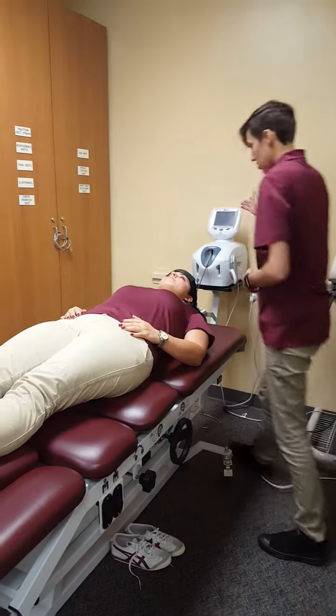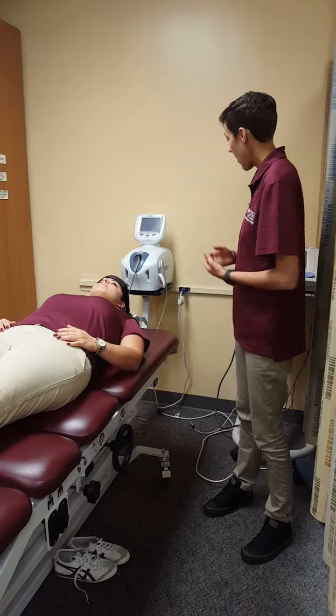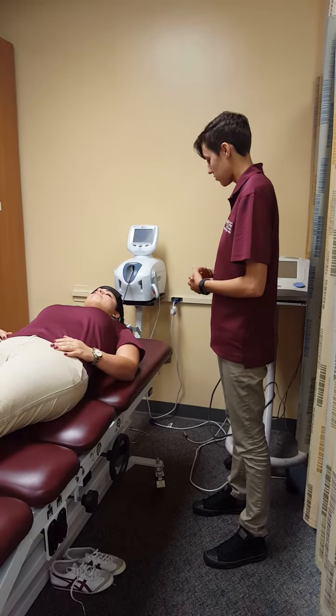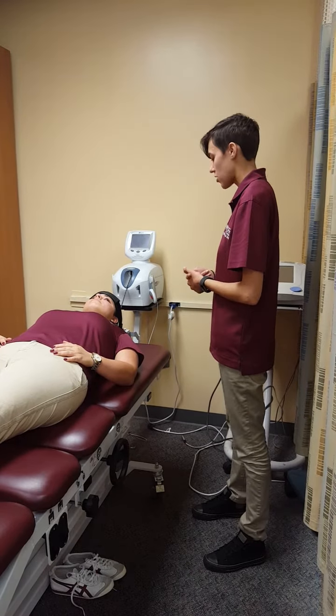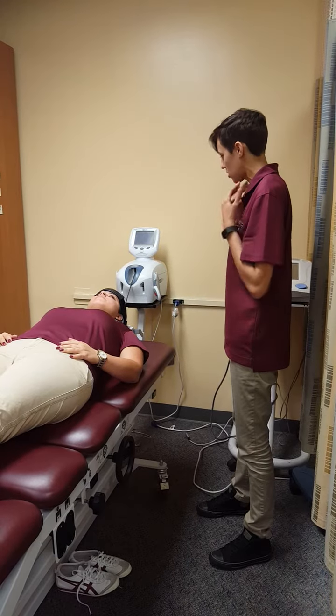Alright, so I've set the parameters on the system: the treatment time is going to be 20 minutes, and the angle of pull is going to be at 25 degrees. We're doing intermittent traction, which just means it's going to be pulling for 60 seconds and resting for 20. So it's going to feel very comfortable.